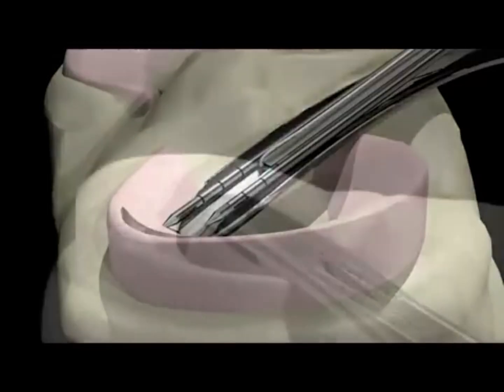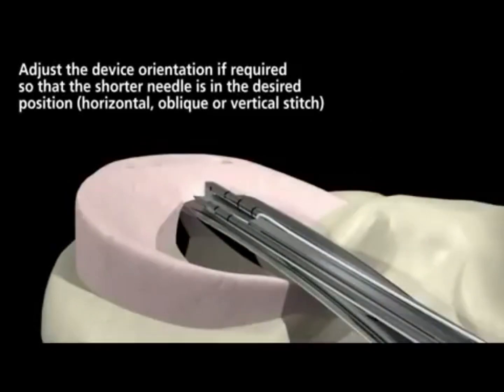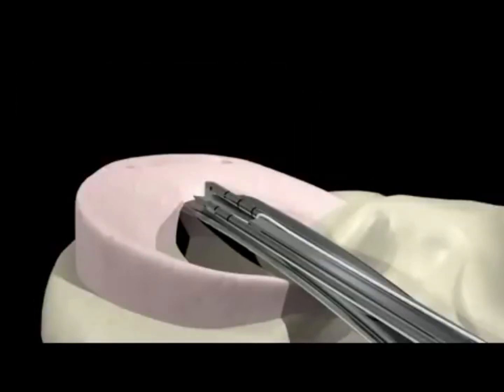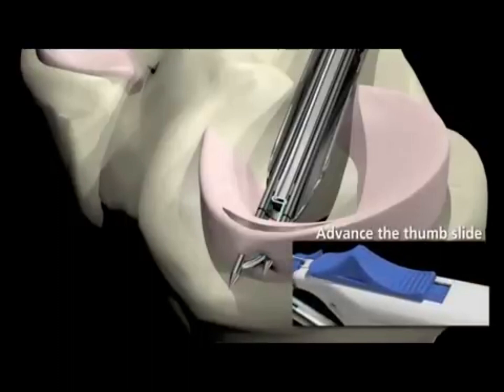Advance the longer needle until it just penetrates the meniscal tissue. Adjust the device orientation if required so that the shorter needle is in the desired location, positioned for a horizontal, oblique, or vertical stitch. Fully advance the needles to the desired depth. Note, the markings on the needles are at 5 mm increments, allowing for the predetermined depth of penetration found in Step 2. Advance the thumb slide to the full extent of its travel.